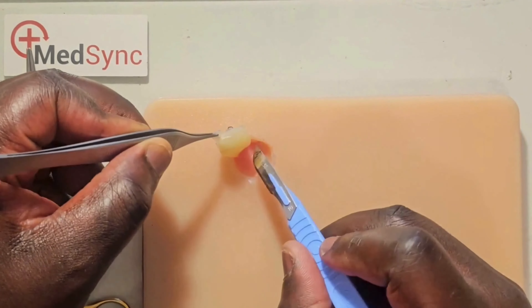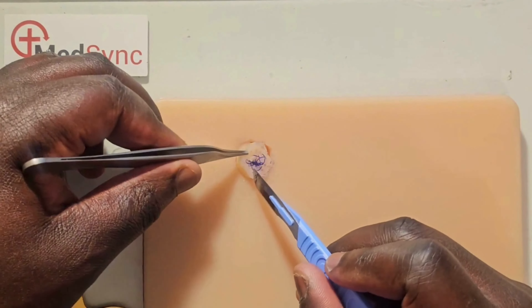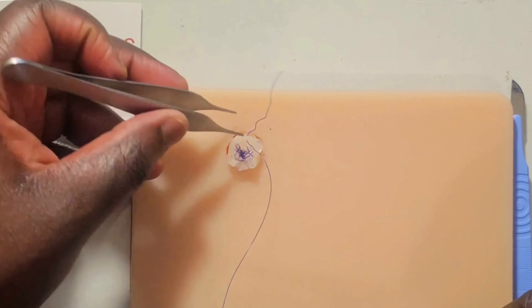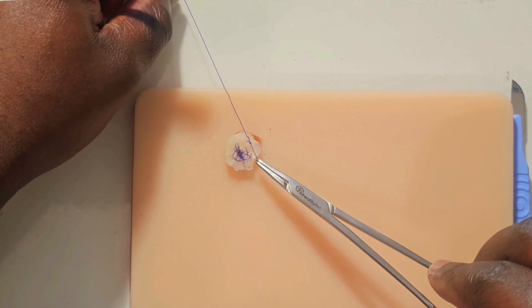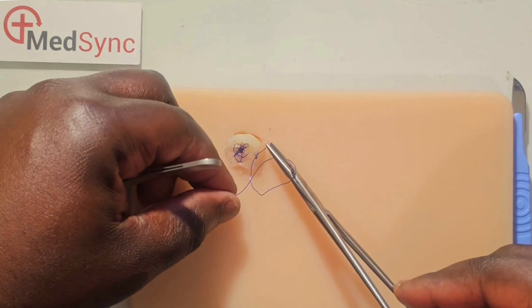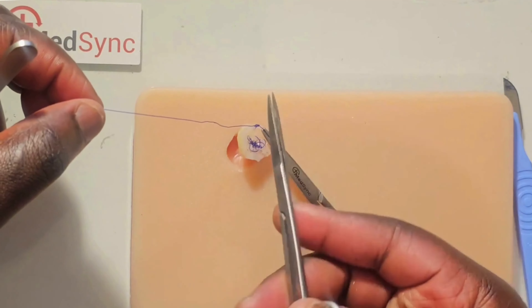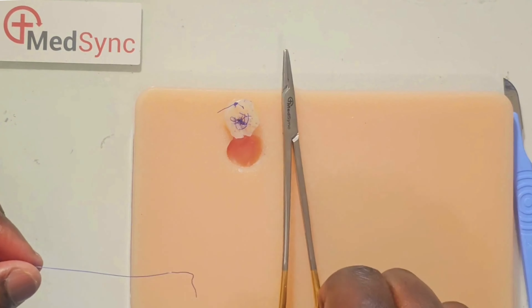Apply traction on the lesion and sweep the blade from top to bottom in a single sweep, repeating this at the same depth until the lesion is excised. A marker suture is placed when the lesion is excised and not being closed primarily. It is good practice to place this in a consistent location — superior, proximal, cranial or anterior, depending on the site of excision.